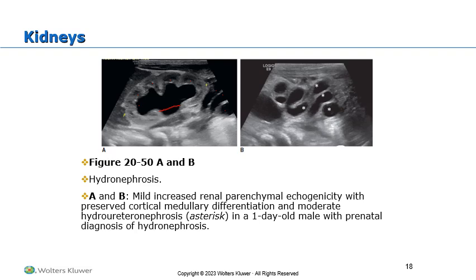Here you see a ureter that has that sausage look, and this would be indicative of something distal to the ureter, so maybe a vesicoureteral obstruction, a posterior urethral valve, something like that would cause this back up into the ureter. Ultimately, after this ureter gets to its maximum size, then we're going to see that collection of fluid within the kidney.